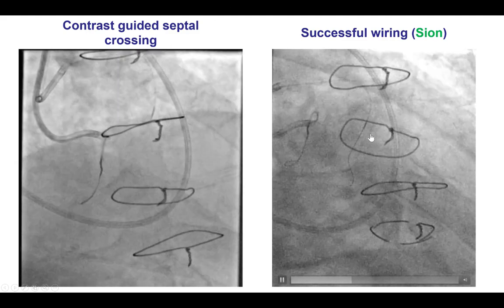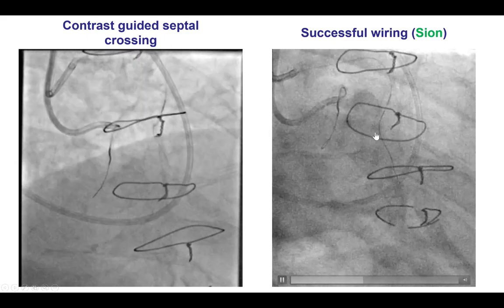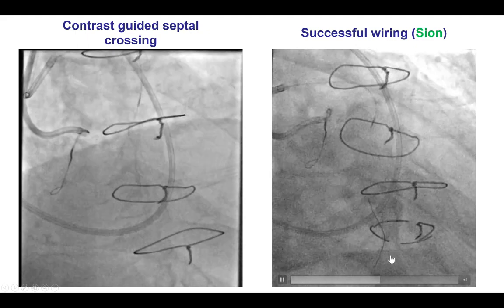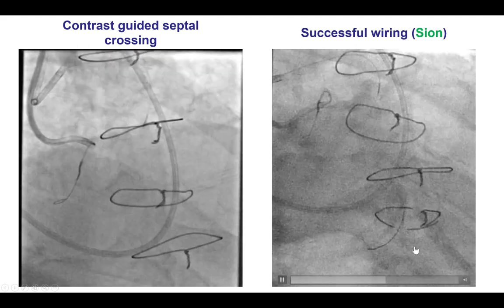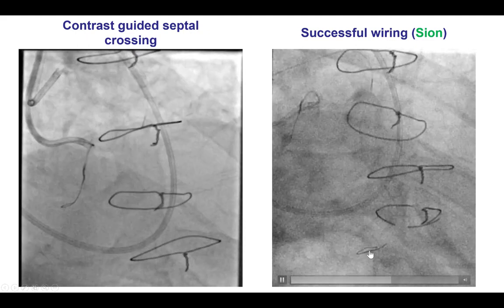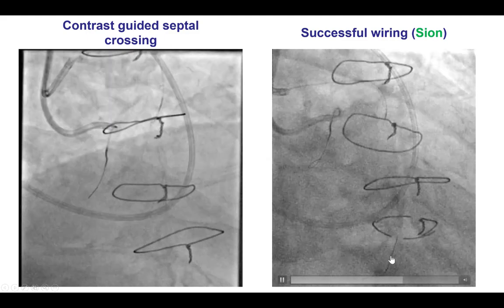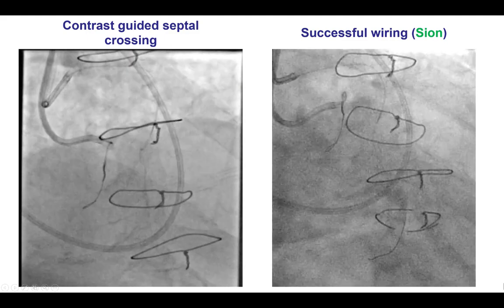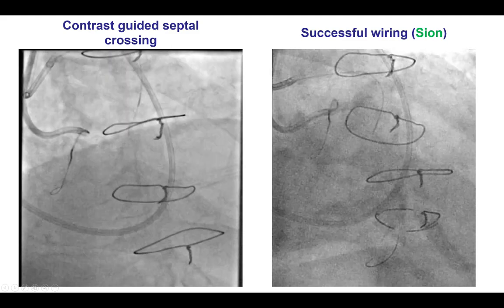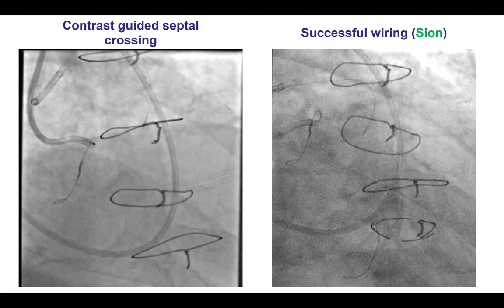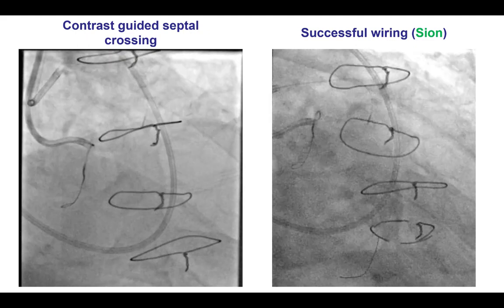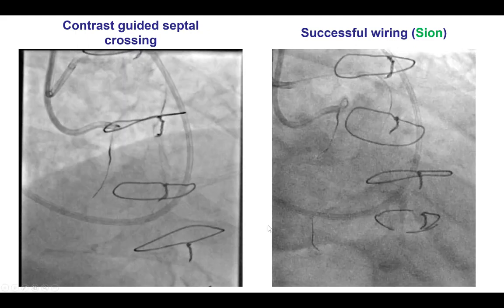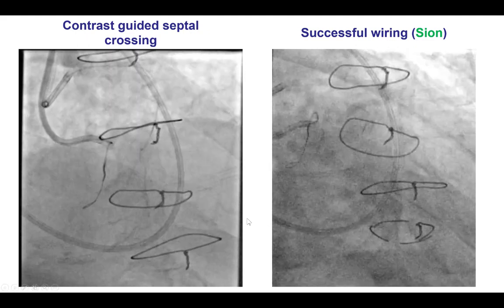This is surfing through a septal collateral branch. Using a Sion guidewire, we were able to advance it distally. It was initially going into the right posterolateral, so it was moved back and redirected, and eventually it did find its way distally into the mid-right coronary artery.